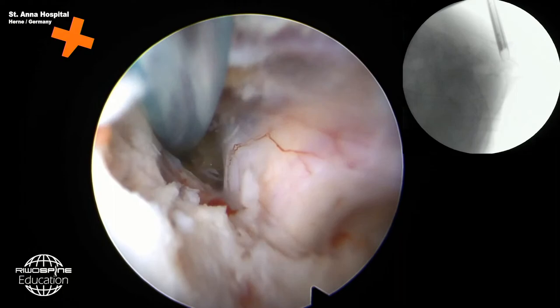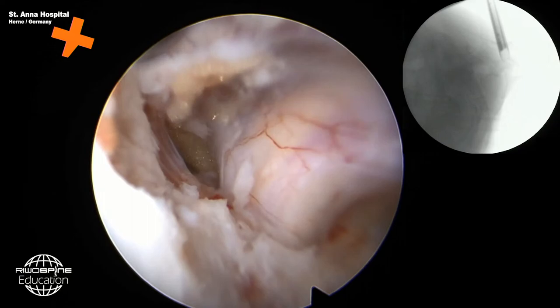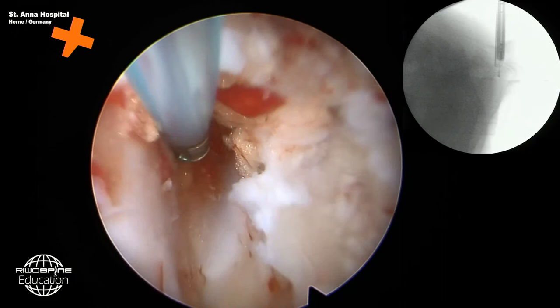Then we need another X-ray, please. And you see how caudal the nerve is. Do we have the X-ray again. Yeah, that's the disc space here. That's the C7 nerve. And here in the cranial aspect, the C6 nerve starts.